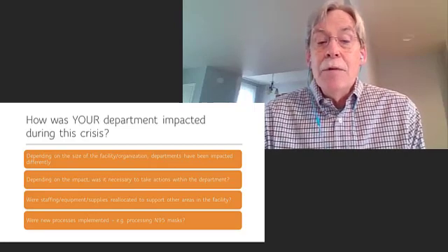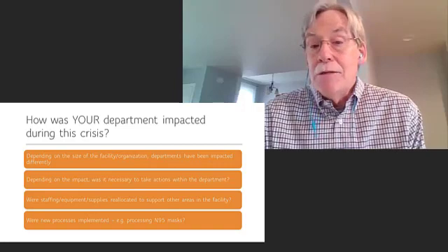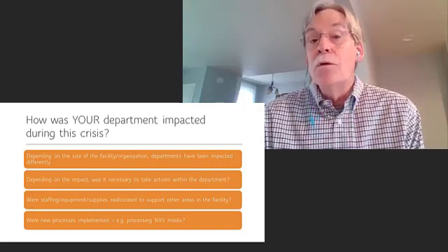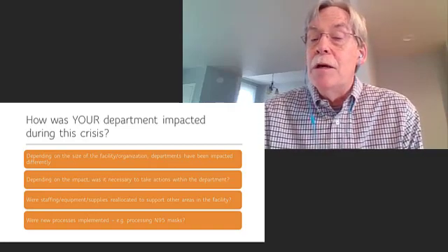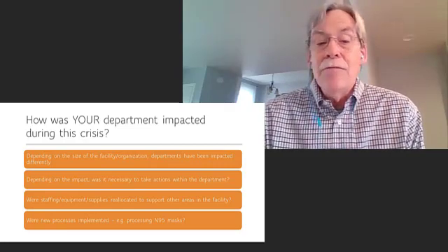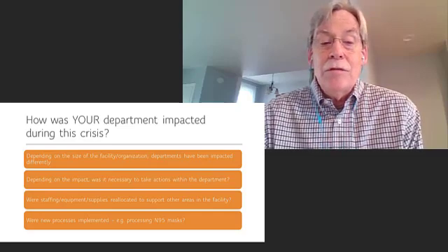So not uncommonly, supplies, especially PPE, were reallocated to the clinical front lines. Supply chain and deliveries for all healthcare items were impacted by worldwide shutdowns. To meet the shortage of N95 masks, processing departments began helping in developing new technologies and/or processes to extend the life of these very critical items. So for especially new processes, this included modifications of existing physical spaces inside processing areas.